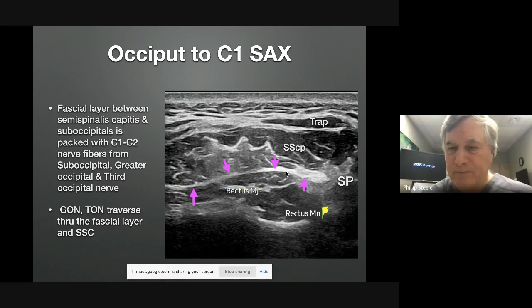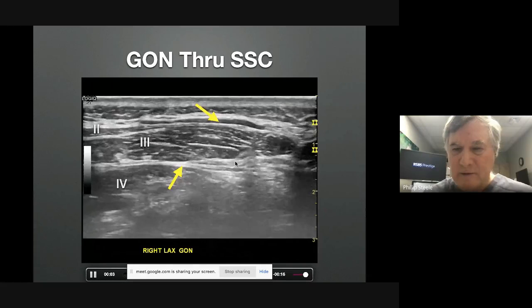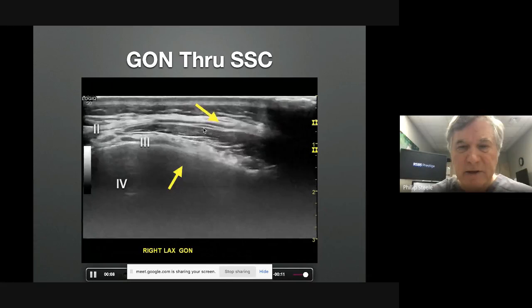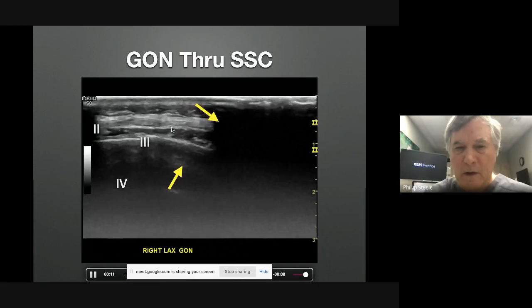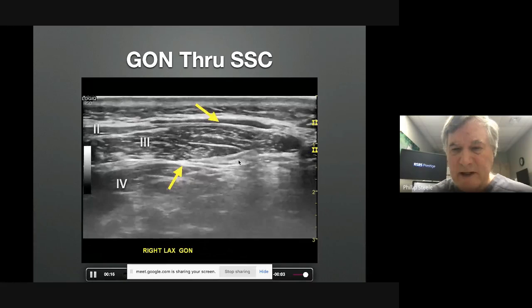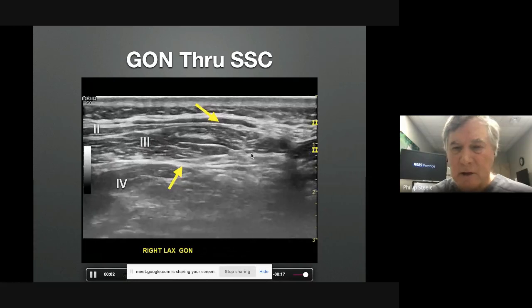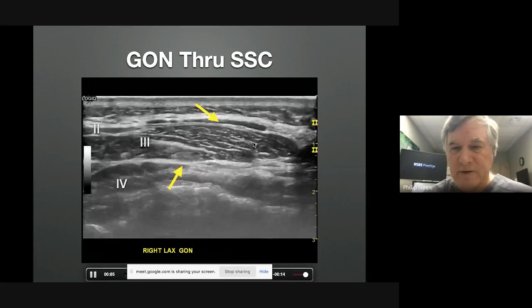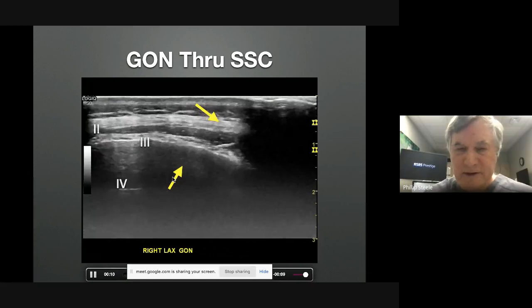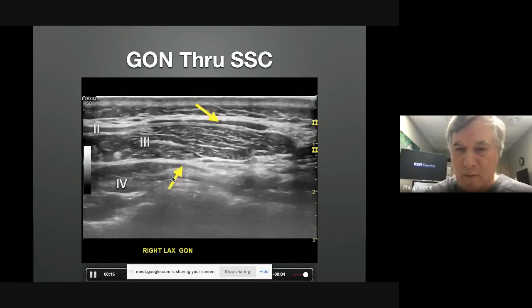Here's our nerve highway. I'm just going to throw one extra slide in here because I love nerves. Everybody knows I like to nerve. This is the greater occipital nerve piercing through the Semispinalis Capitis. So when you treat greater occipital nerve headaches, you need to open this up. There's where the entrapment is. Everybody else is sort of teaching you to inject down here. The problem is here, as it moves through the Semispinalis Capitis, and it takes a 180-degree corner, which is part of helping accommodate turning your head, but it also is part of the problem.